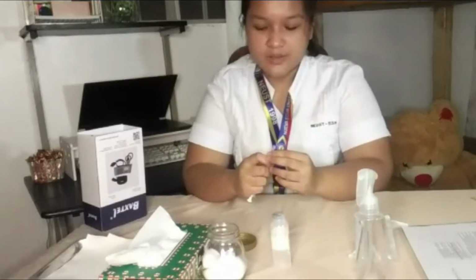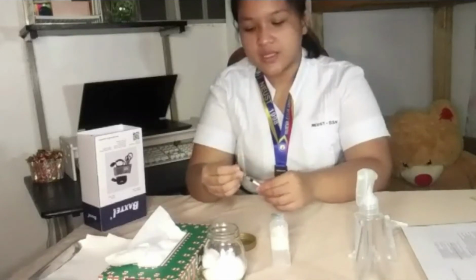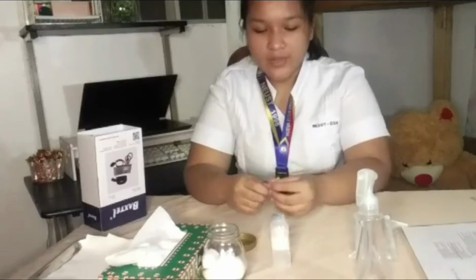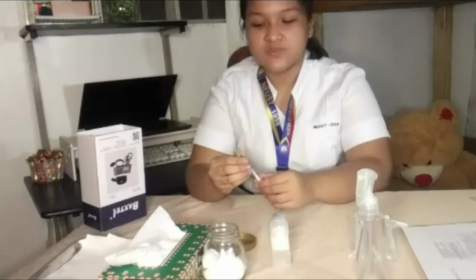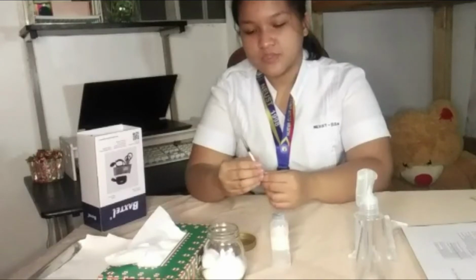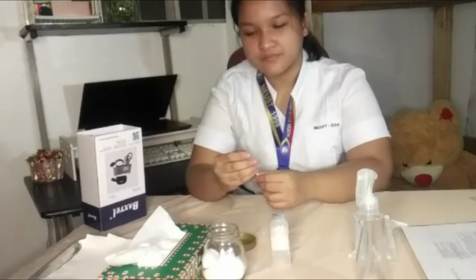Before aspirating the medicine out of the vial, I'm going to remove the cap of the aspirating needle and aspirate air equal to the same dosage of the medicine that I am going to take from the vial.